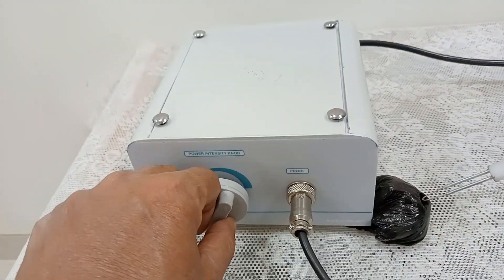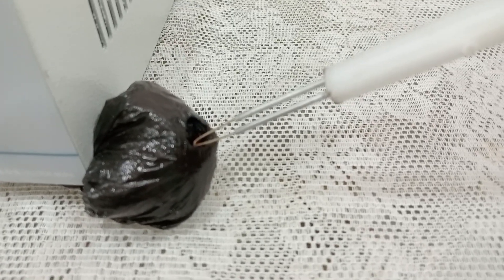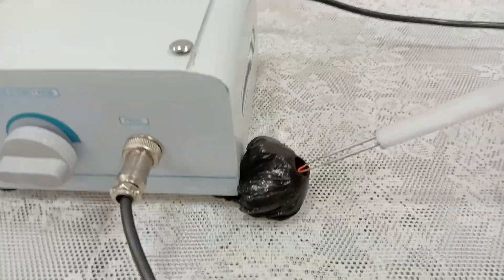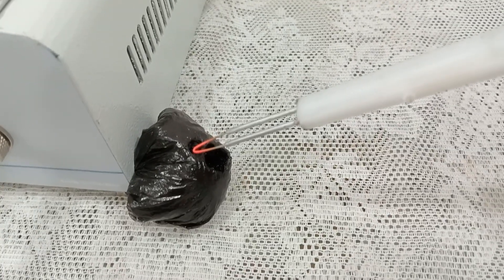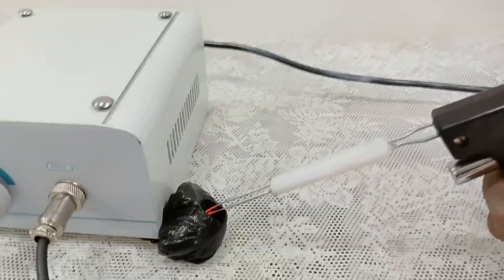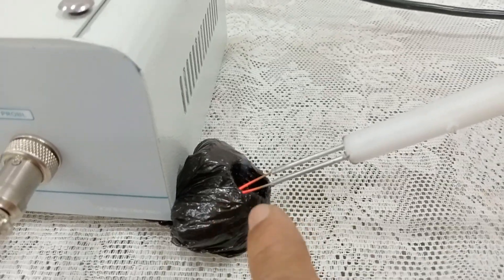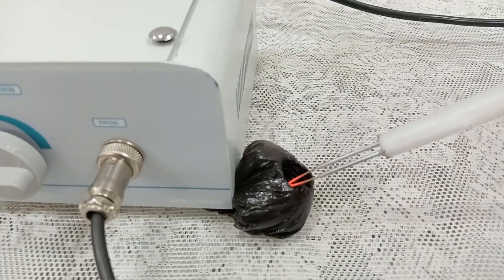Now we go to the second intensity, and then to the third intensity. This is how the electrode gets red heat and you can use it accordingly. It can even be used for circumcision and for gynecological purposes.